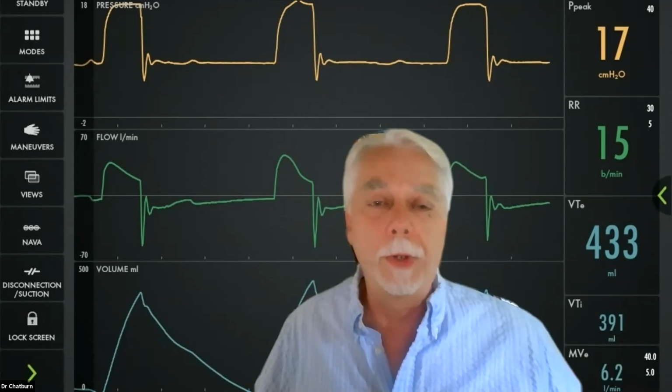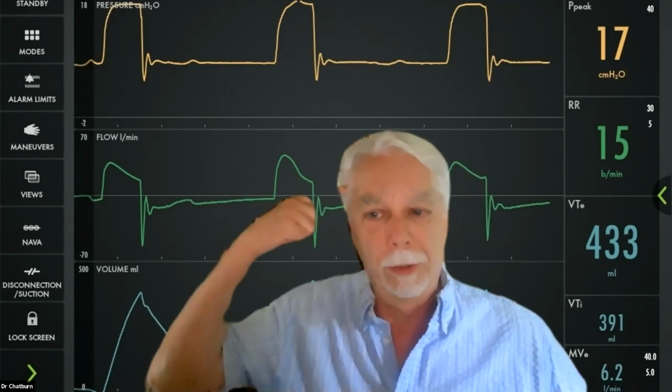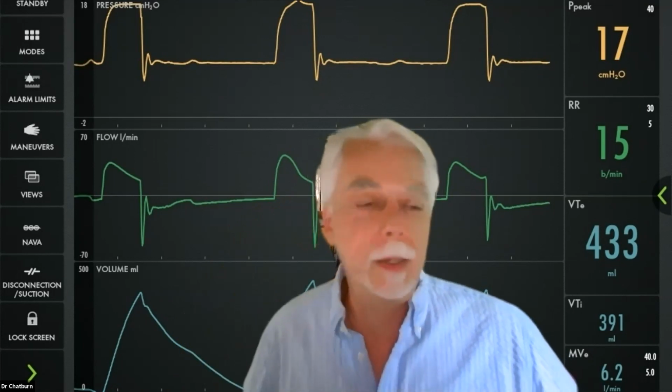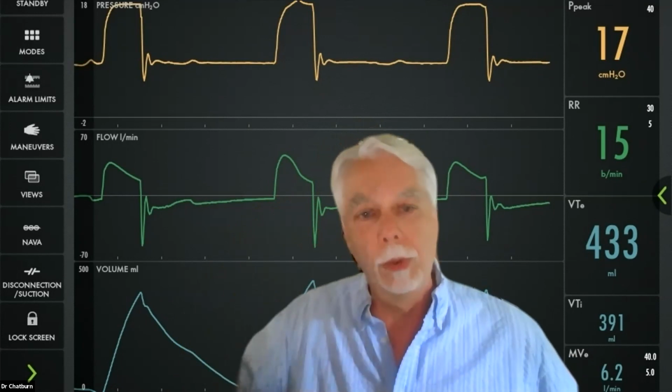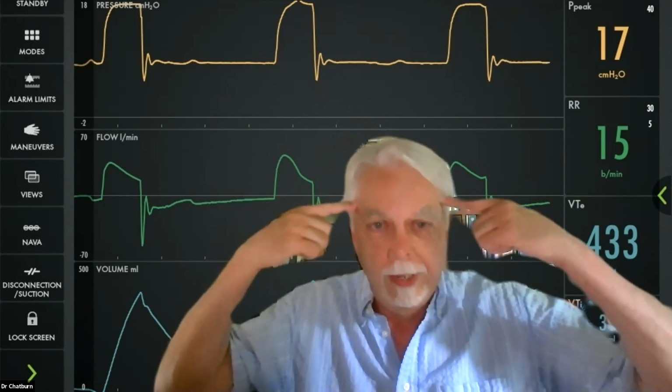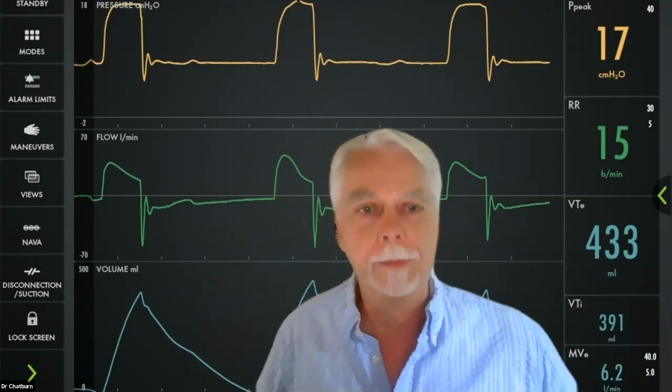When we connect an artificial controller with a natural one, the relationship between them will not be perfect at different points in time. Of course, that's right. Do you think that we have to target the minimum amount of non-ideal interaction, since we cannot have a perfect one at all times? Yeah, well, the artificial controller is a vent and the natural controller is the brain, right? Correct. And amazingly enough, there has actually been at least one paper where some engineers controlled a ventilator with brain signals directly from the EEG.